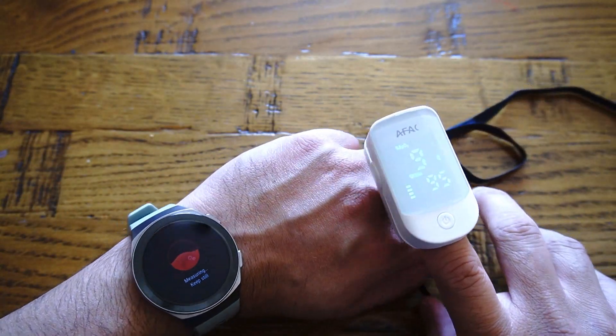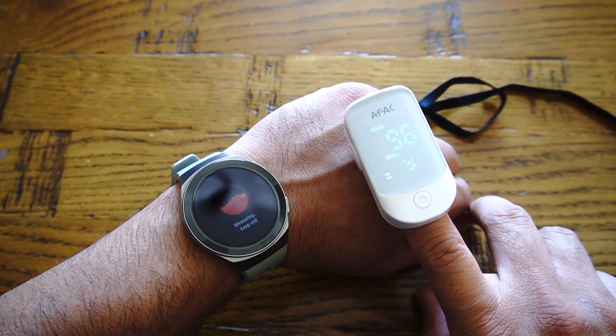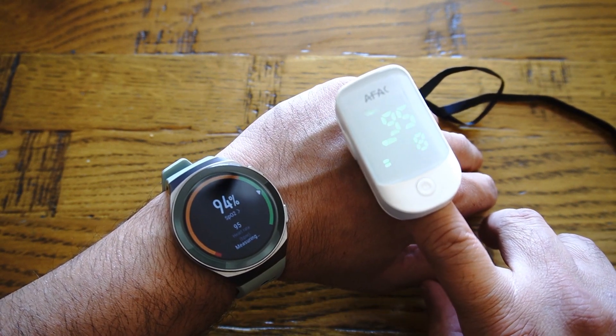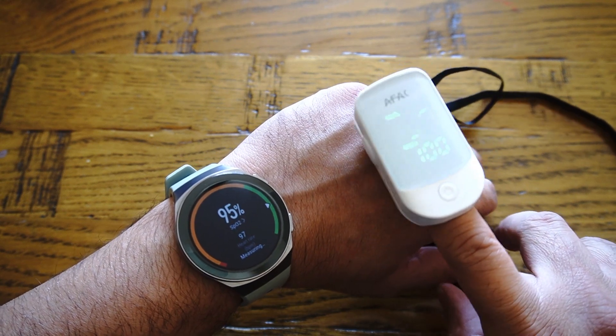Here I have a comparison of this pulse oximeter with my smartwatch, the Huawei GT2e, which comes with an SpO2 pulse sensor. Both readings are shown on the same screen so you can see the difference between the two.